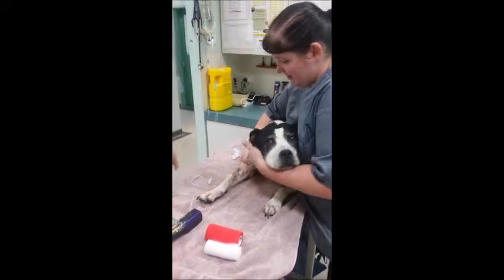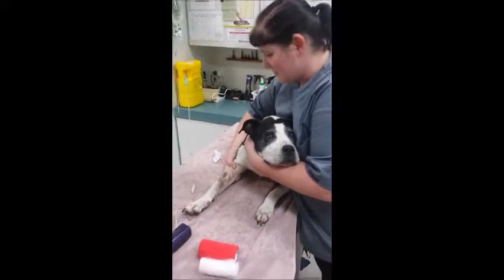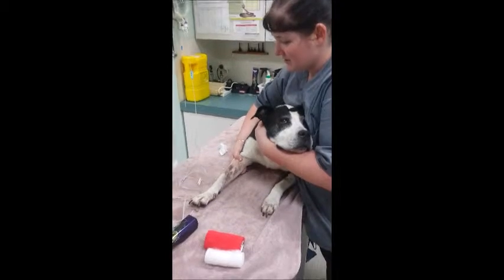Using my hand that is supporting the foreleg, I use my thumb to roll the vein, which causes it to raise the vein for the placement of the catheter.